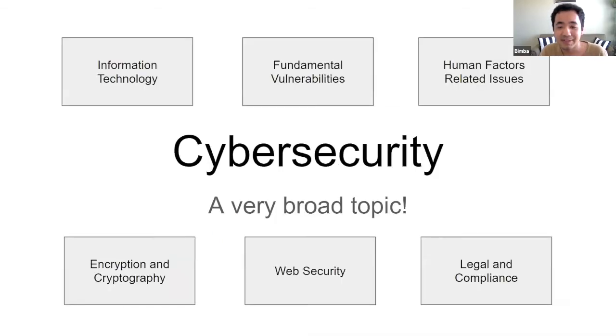So when I say cybersecurity, I could be talking about just about anything. I could be talking about the IT side of things, what a system admin would do. Cryptography, AES cipher suites. Web security. Lots of medical devices have a web interface that you can use to interface with the device, or in some ways lets you provide input to the device. That's a potential attack vector.